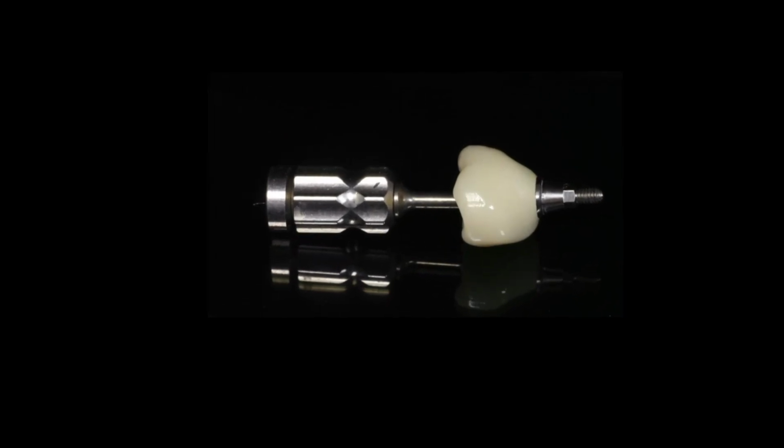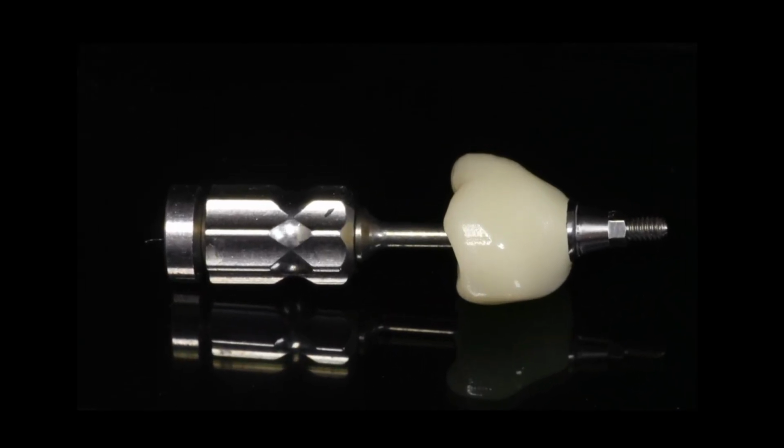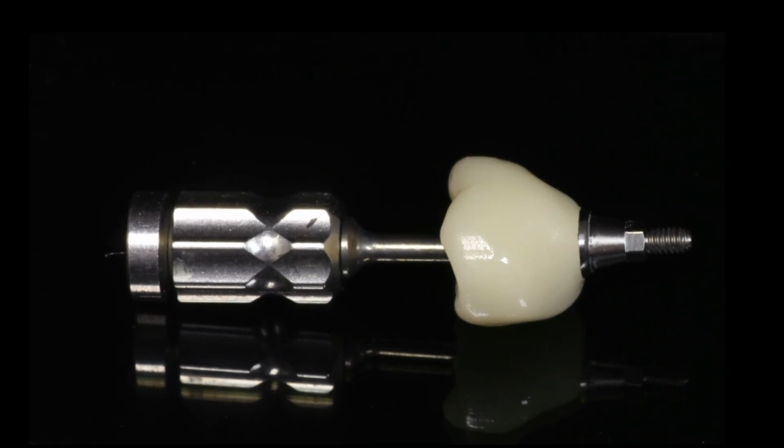And that completes the process of using Multilink Hybrid Abutment to bond an Emax abutment to a Sirona titanium base. Notice how well the high opacity blocks out the titanium base from showing through the porcelain. You are now ready to deliver the restoration to the patient.